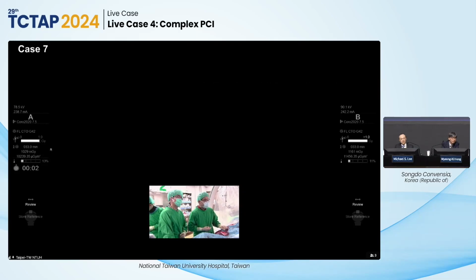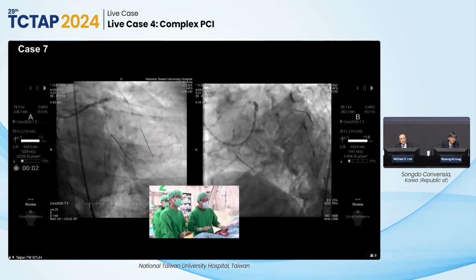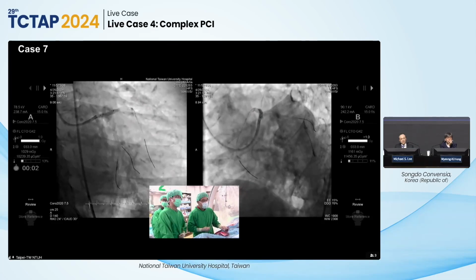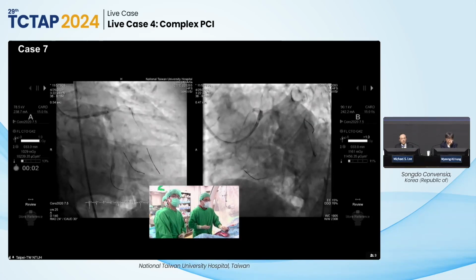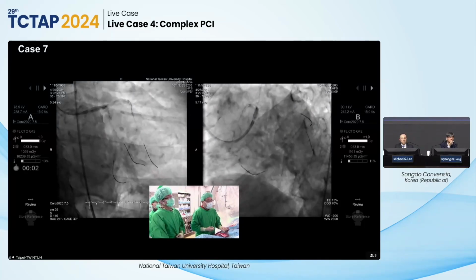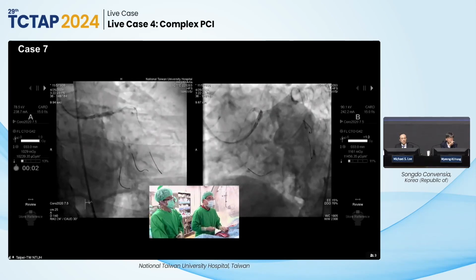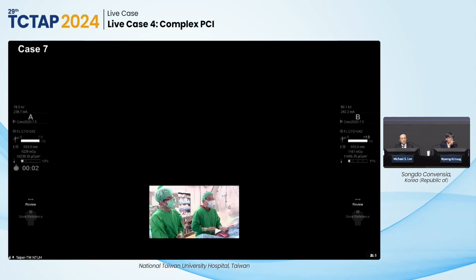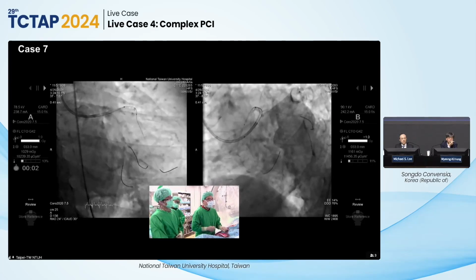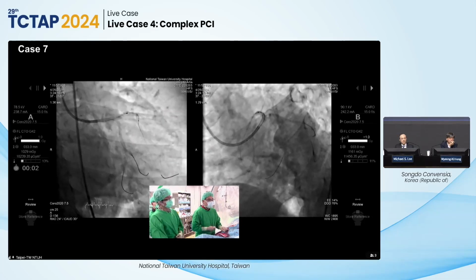Next. And then we applied the same IVL balloon on the left main LAD as well. But you see this one opens up quite nicely, much better than the circumflex. Next. So actually we have used 20 shots on the left main LAD, so the balloon had another 20 shots. Probably offline we will work on the RCA with the same IVL balloon. Next one. And we did the IVUS run and OCT run, which I will now show you. But anyway, this is just to define the choice of our stents. Next one.